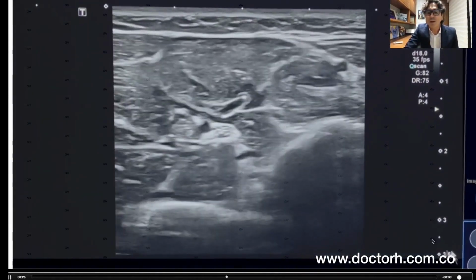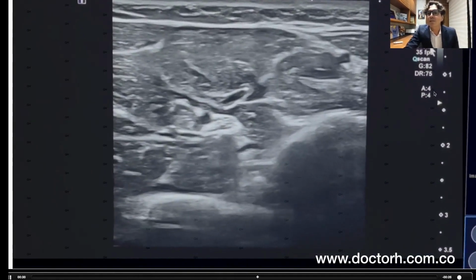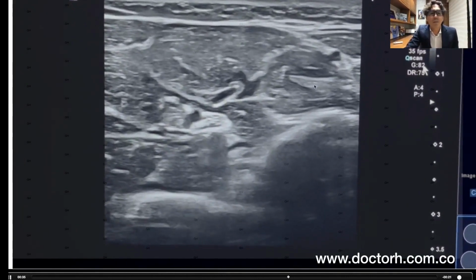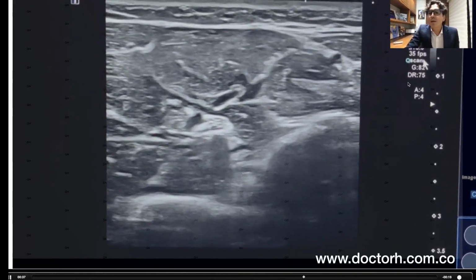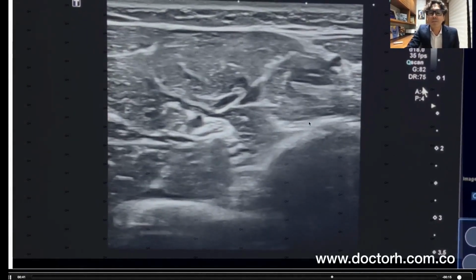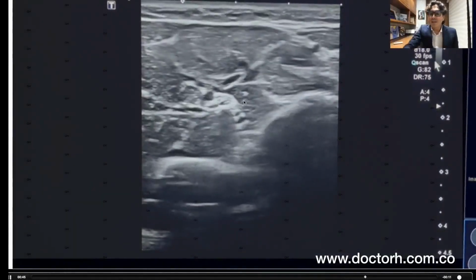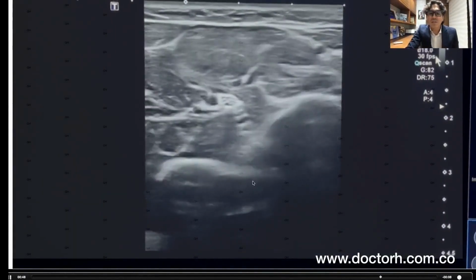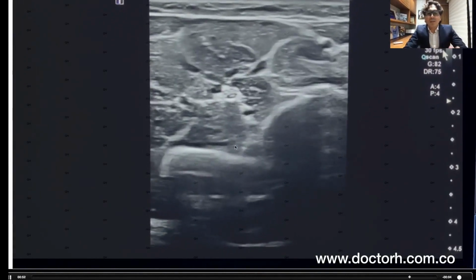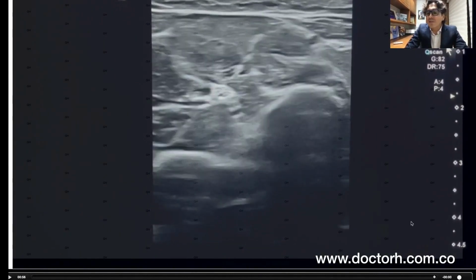Look how we're going down here to 3.5, and we can take it up to 7 centimeters, and it will mark it on the scale. So the depth, which we can manage from 1 centimeter up to 7 centimeters, will allow us to see images more closely or deeper, as in this case where we go up to 4 centimeters. We will lose more detail in depth, but if we want to reach this area, we have to deepen our probe.